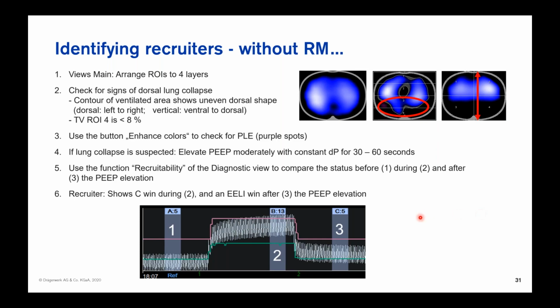Whenever you have a patient with an evenly large ventilated region with dorsal ventilation in the regions of interest of more than 8%, we probably do not see any need to even test lung recruitability, because those images most of the time already tell us clearly that whenever the patient has issues with gas exchange, it's probably not related to the ventilation distribution.